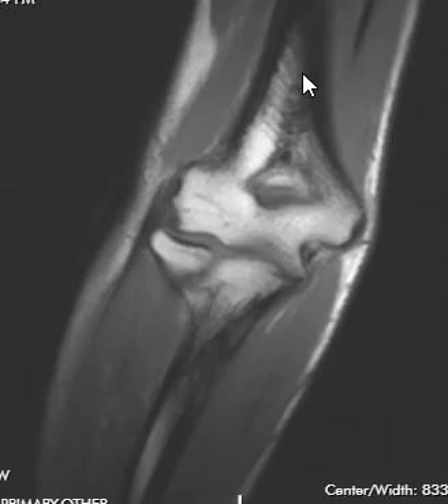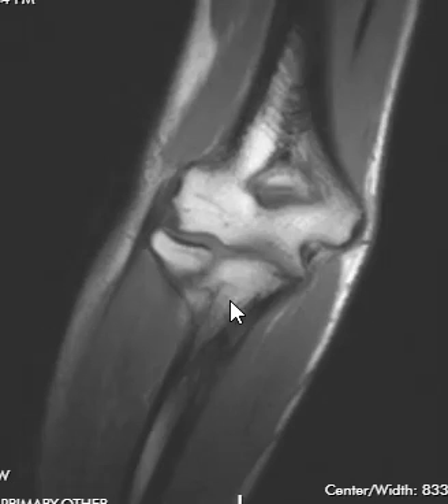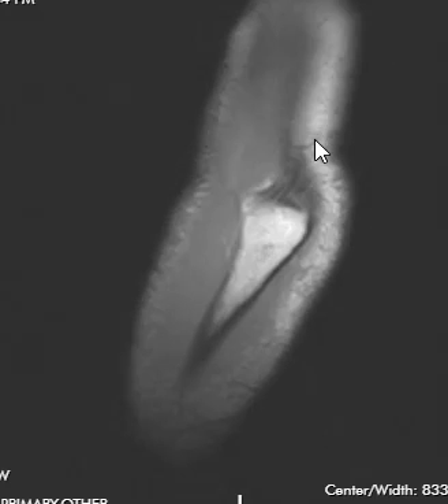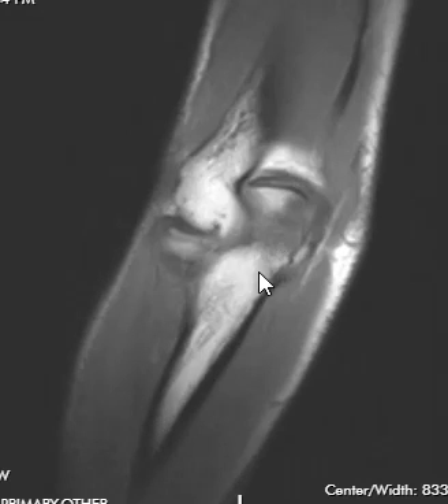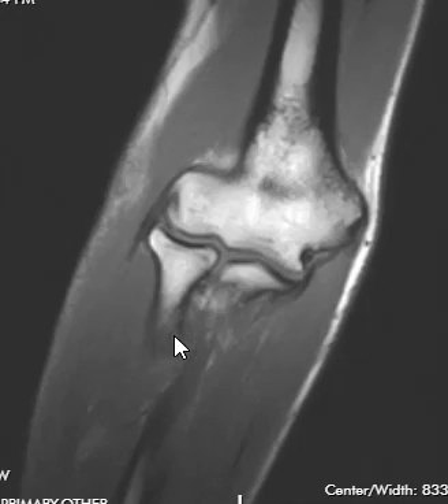Then we go to the coronal view, which is my favorite sequence. On the coronal view we see more anatomy: the humerus up top coming down, and in the forearm we see two bones — the ulna, where the triceps attaches, and the radius. This little bump here is the radial tuberosity, where the biceps tendon attaches.